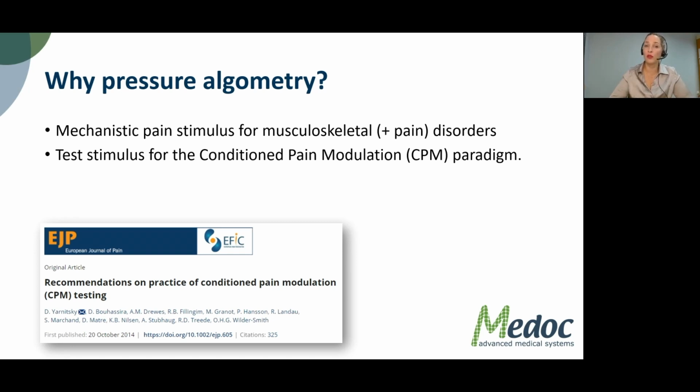So again, for instance, pressure algometry, and then we see the differences and we see how much inhibition there is in this patient. And if you would like to learn more about CPM and how CPM is performed and some research that has been published about this, I would very much like to invite you to watch our CPM webinar on our website in the recorded webinar section. So this is some more information that you can gather.